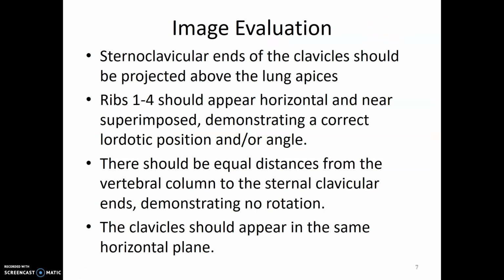Image evaluation is really similar to that of PA chest, so you're going to look for your SC joints, and are they equidistant, but they need to be projected over the lung apices. If they're still in the lung apices, you need to angle up more. All right.